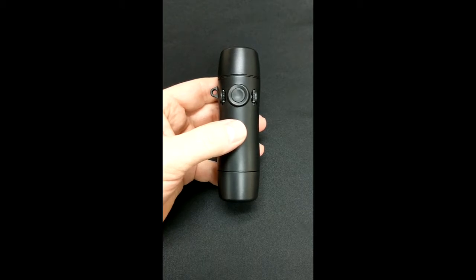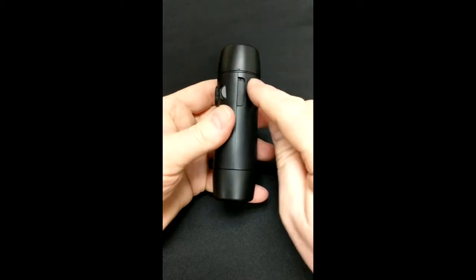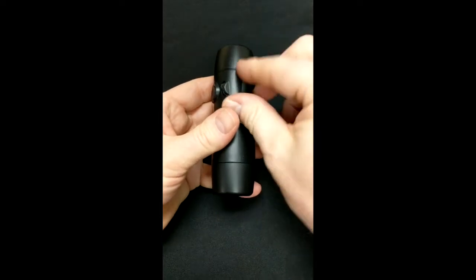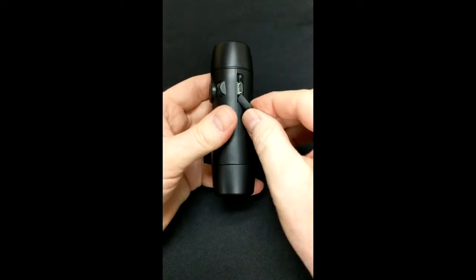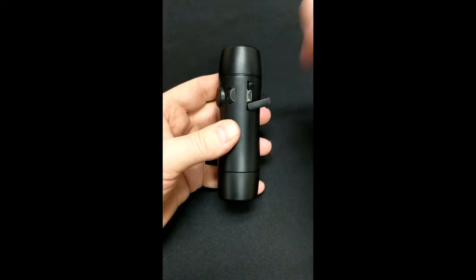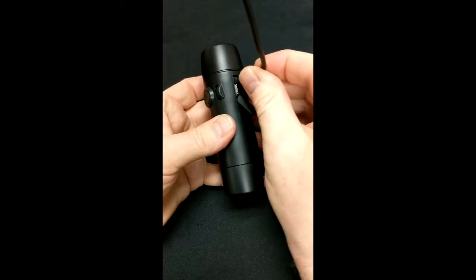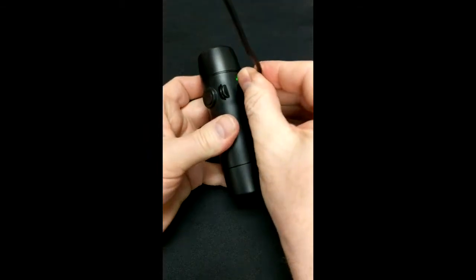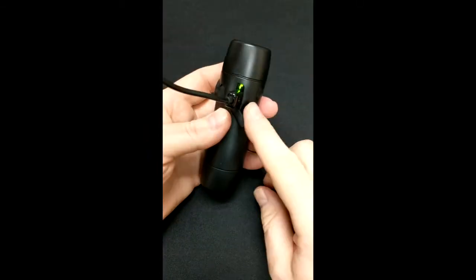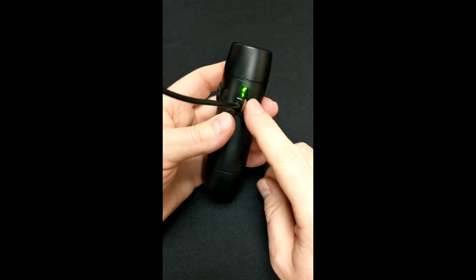The Truetone Emote charges very simply. You just pull back the dust cover and expose the micro USB port. You simply plug the micro USB cable in, the LED light comes on to indicate that it's charging.